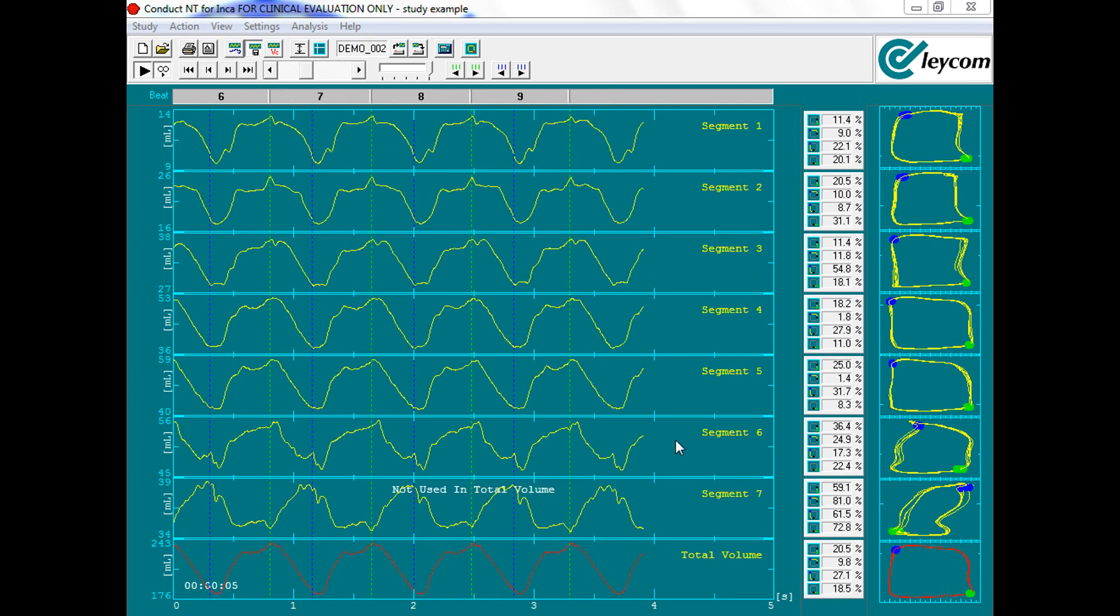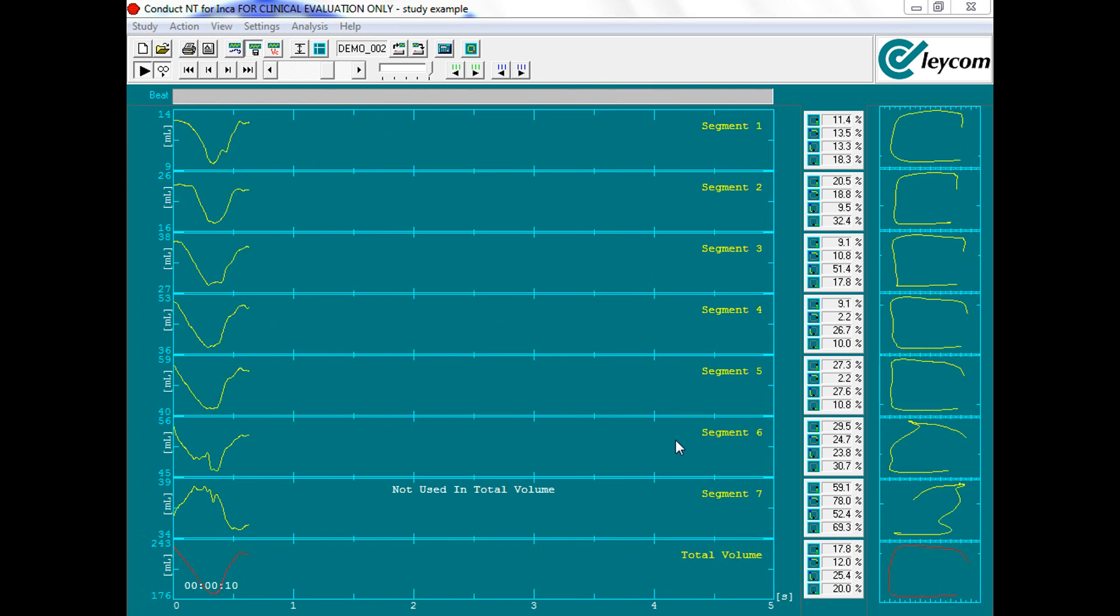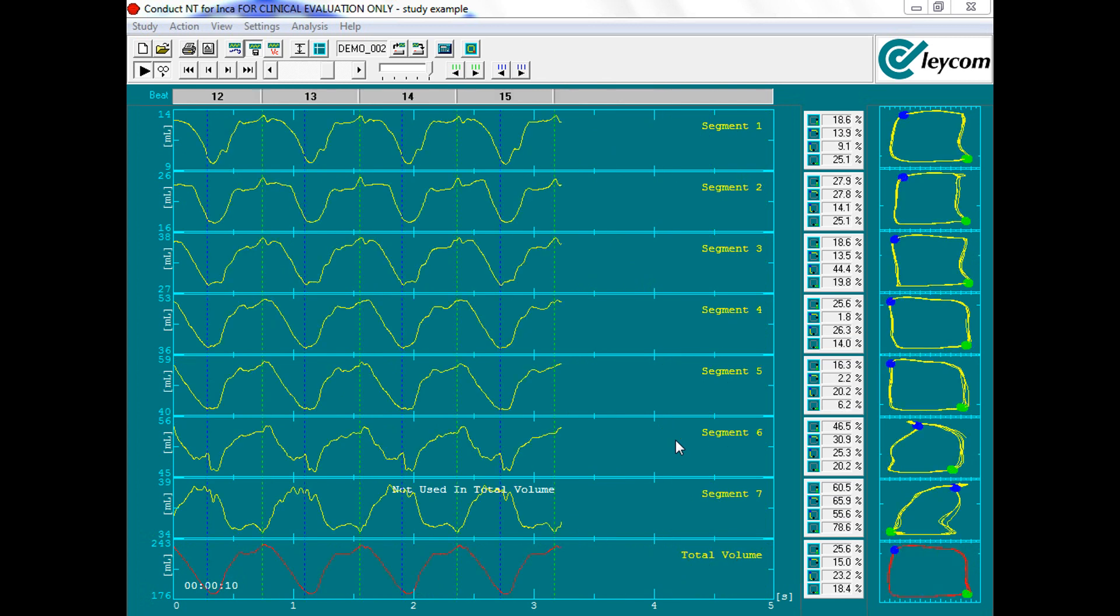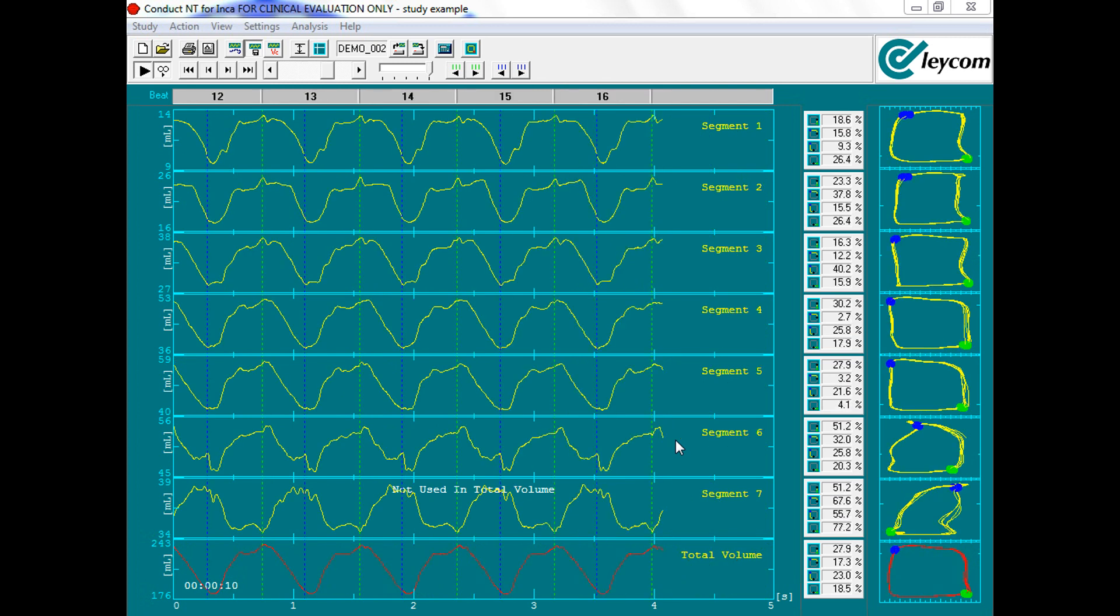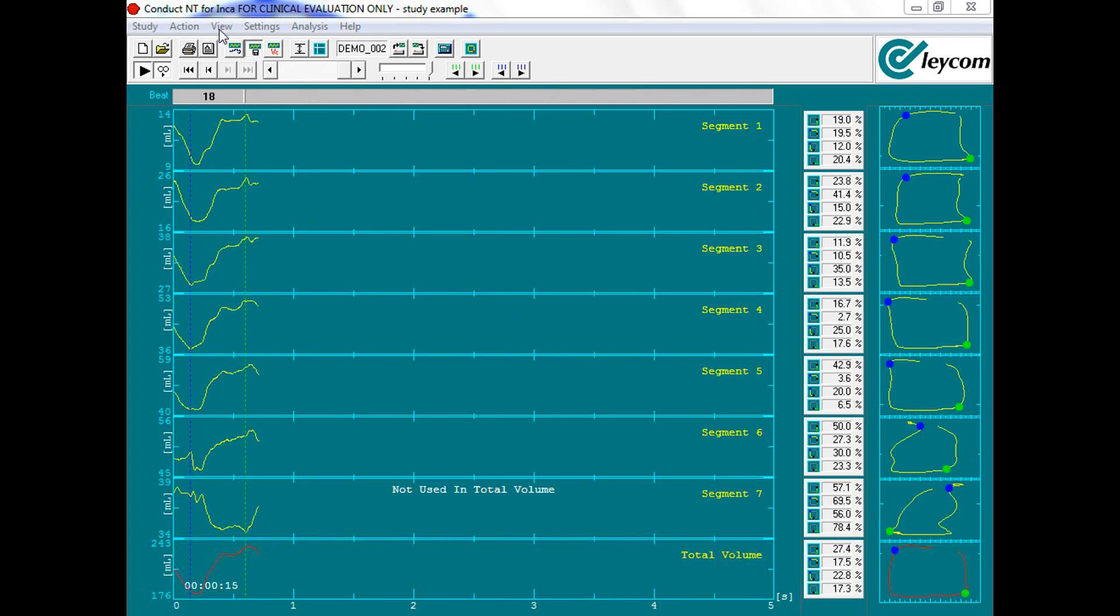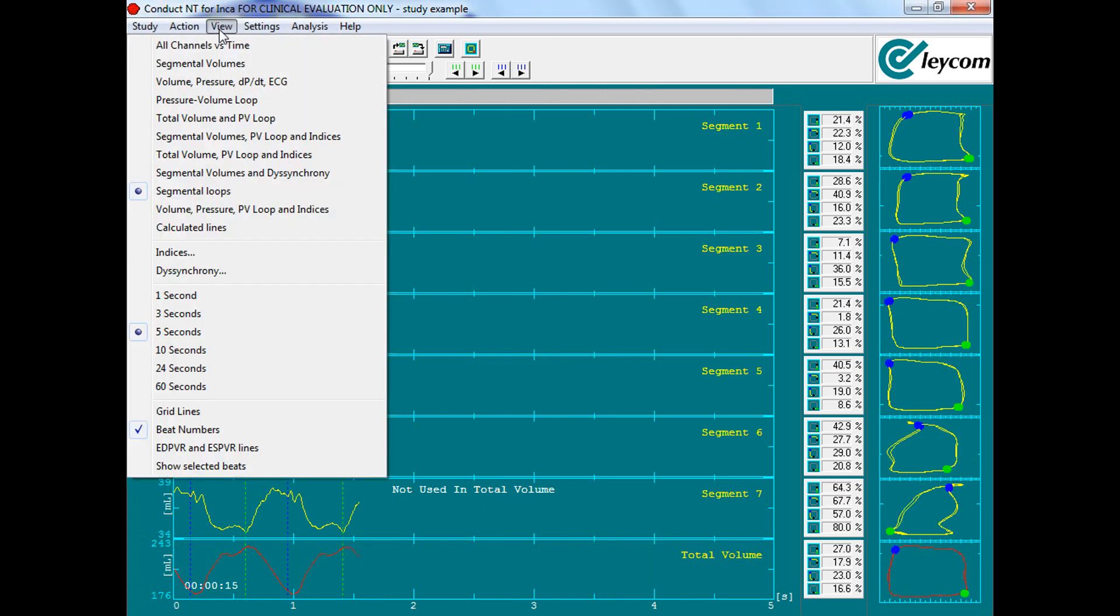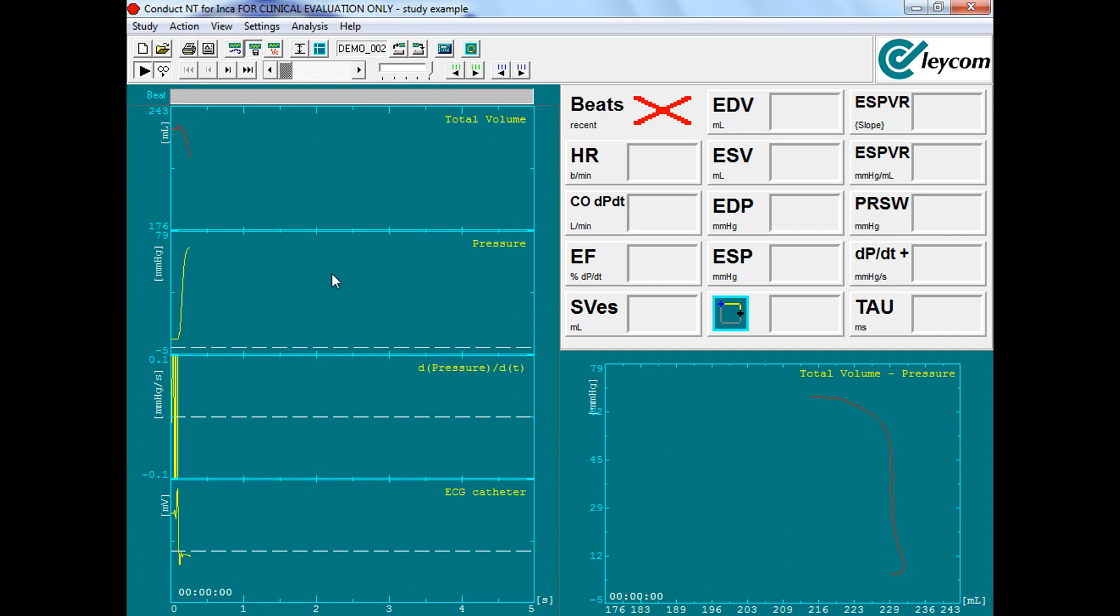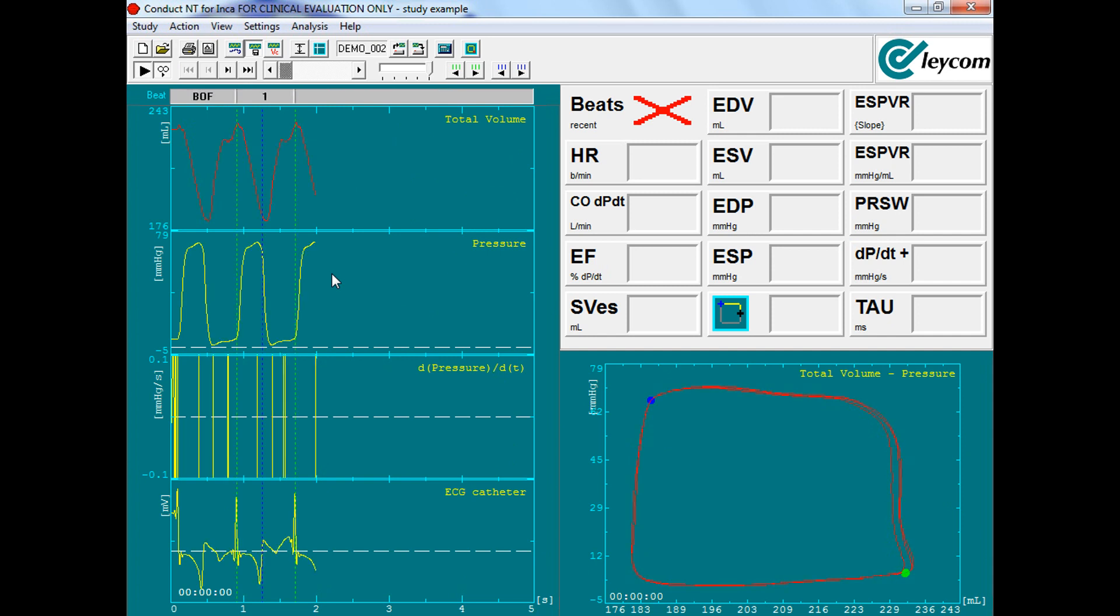At this point, we have optimized catheter positioning, removed any unneeded volume segments, and are ready to begin data acquisition. Start by switching back to our monitoring view, total volume PV loop and indices, and you're ready to begin recording PV loop data.